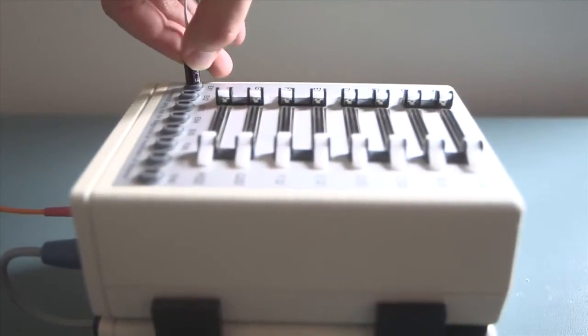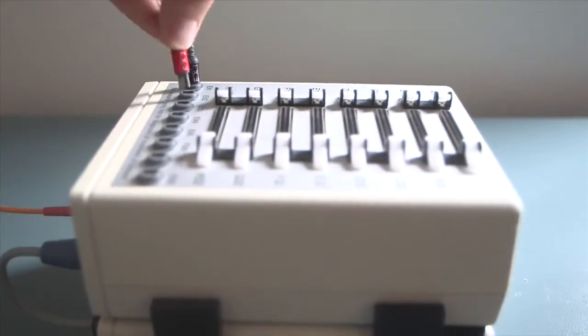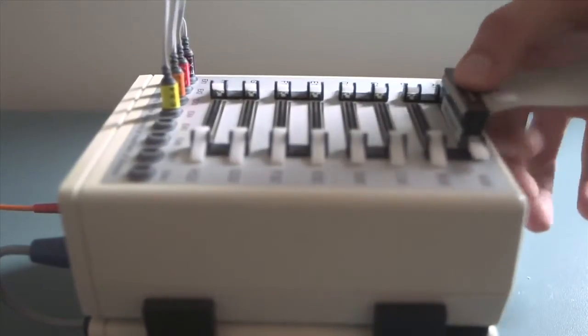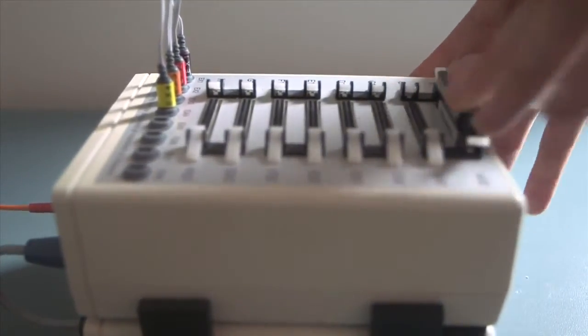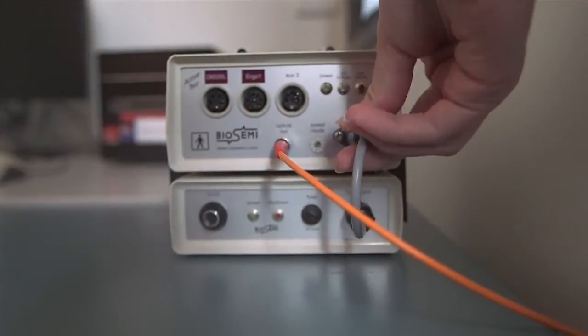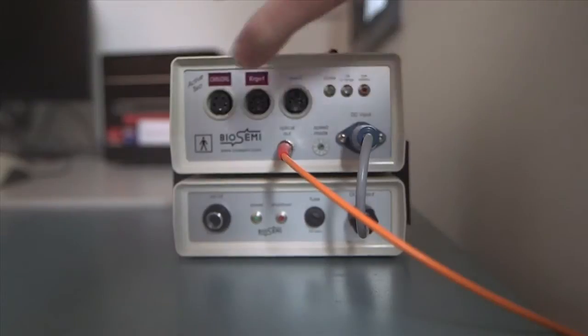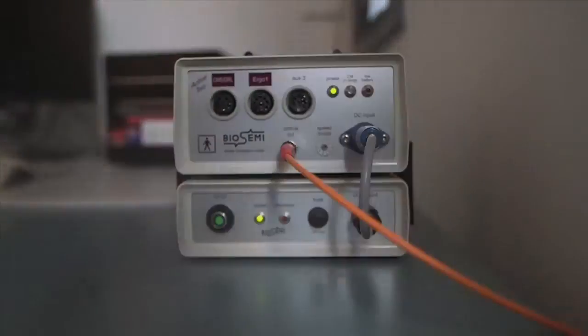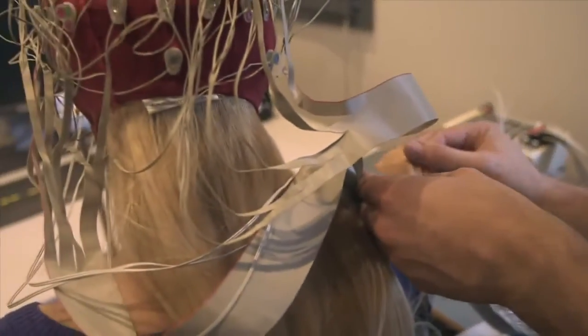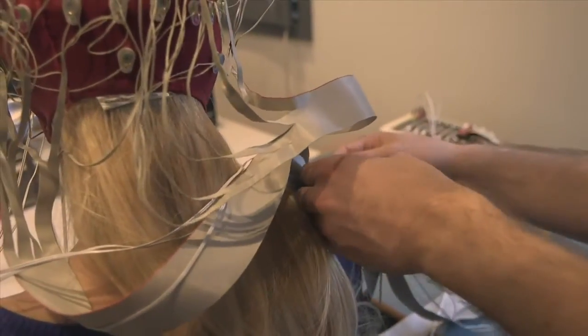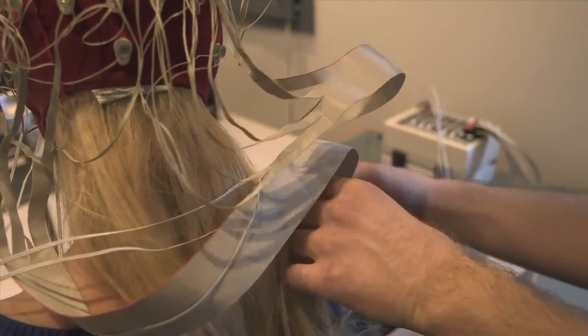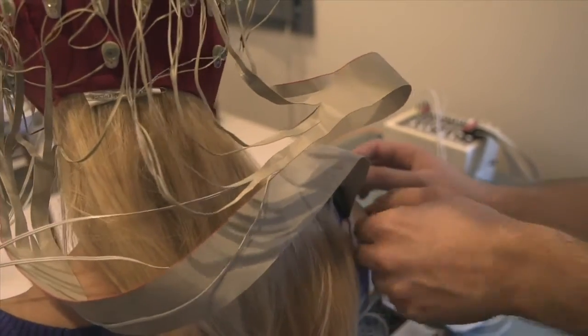The next step is to connect the external electrodes to the amplifier, as well as the two electrode sets. Connect the amplifier to the battery and switch it on. Once all the cables are connected to the amplifier, make sure you tape them to the participant's shoulder, and ensure that there's a fair amount of slack so that there'll be no pulling on the cables, even if the participant moves their head.